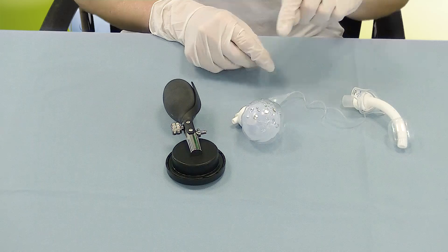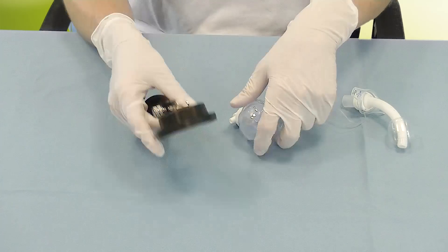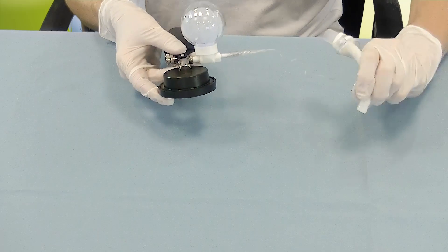To get a precise reading of the cuff pressure, this function is disabled the moment a hand manometer is attached.